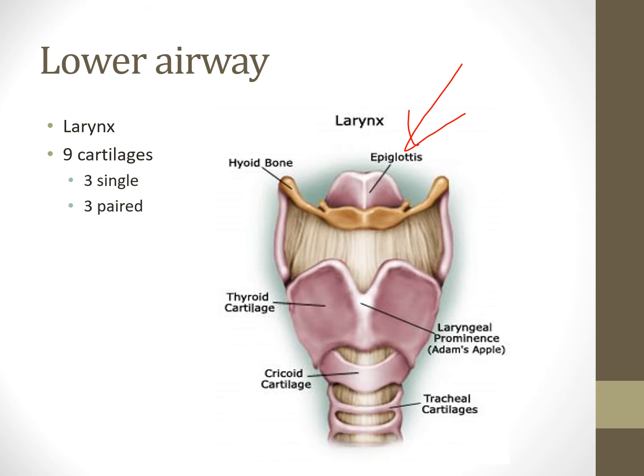But in general, in adults, we want to control the tongue, especially if they have a swollen airway, things like that. We want to move it out of the way, and that's why we do this. And remember, the epiglottis is displaced in both blade styles for intubation. The indirect one, which is the MAC blade, goes into the vallecula and actually shortens this little tendon here. So the tip goes into that vallecula, shortens the tendon, and pulls that epiglottis up, or anterior, or superior if the patient is lying supine. It puts tension on that tendon and lifts the epiglottis, so you have an open view for intubation.